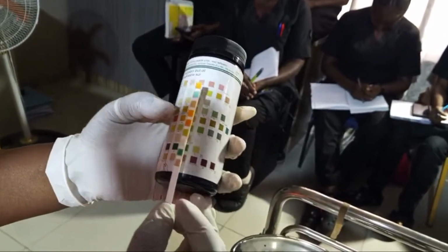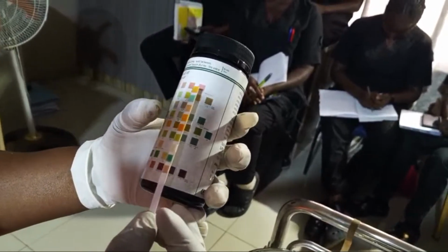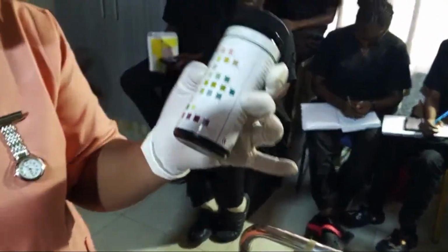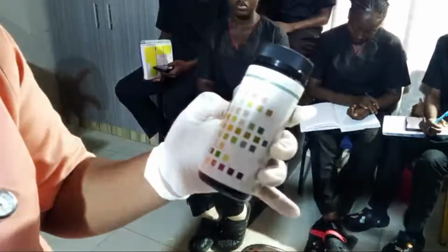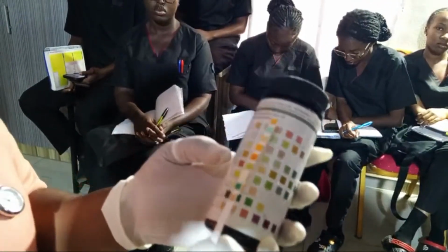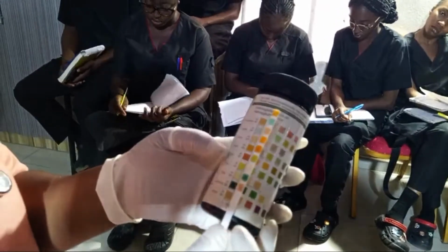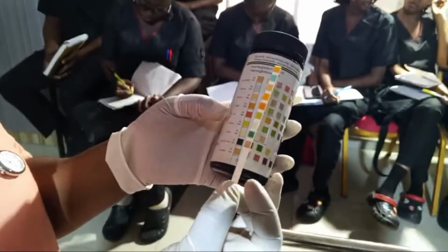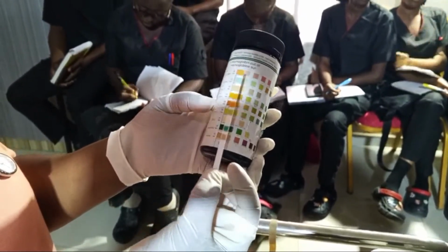See it here. And always check on the manufacturer's instruction. You see 2 pluses, 3 pluses, right? So for glucose it is nil. So you indicate nil. Remember, for this patient, we said we want to know the glucose level. So the patient is not diabetic because there is no glucose in the urine.